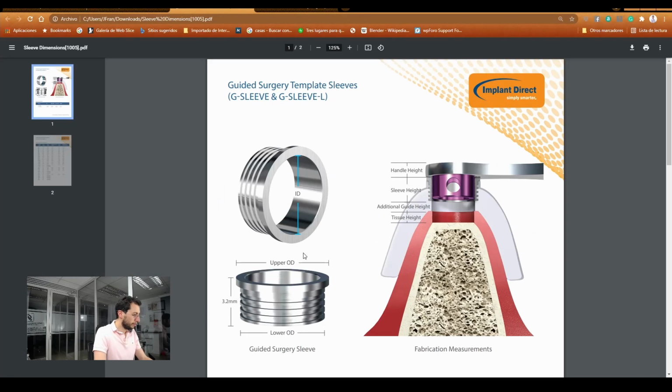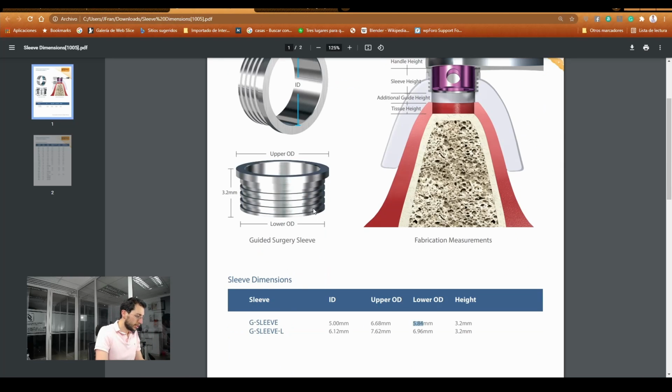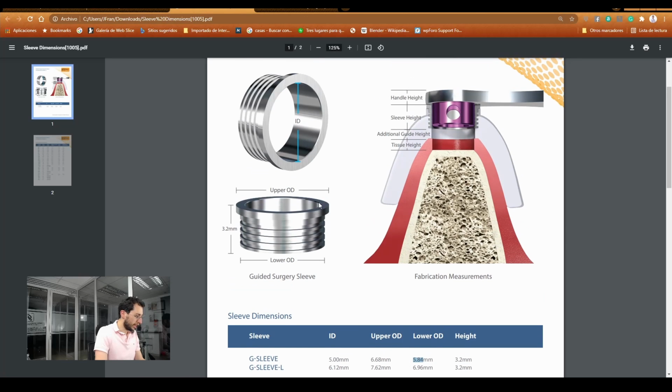That's perfect. Finally, I need this height, this small step height. Since it is not described in the catalog, what I did, or what we did, is to use one of these, a digital caliper or gauge, and measure that dimension. In this case, it is 0.5.